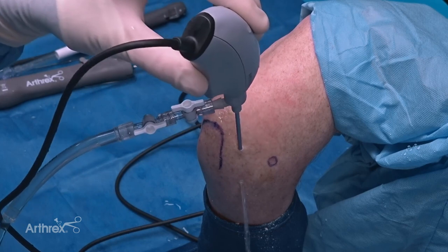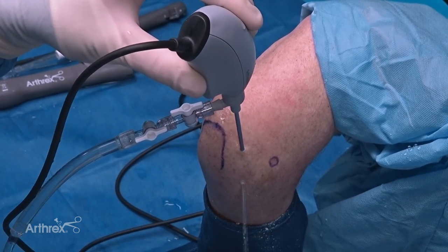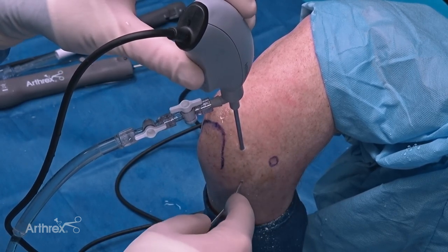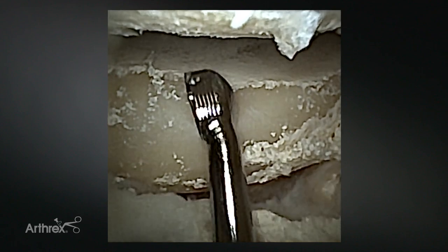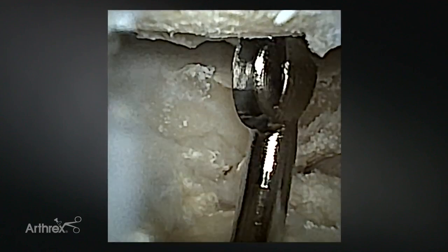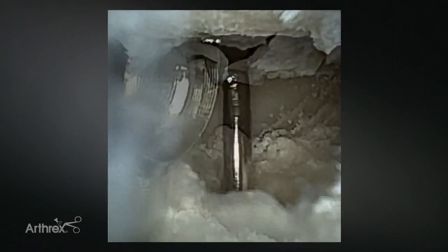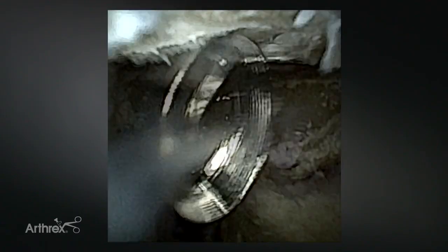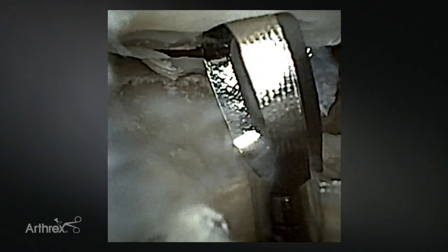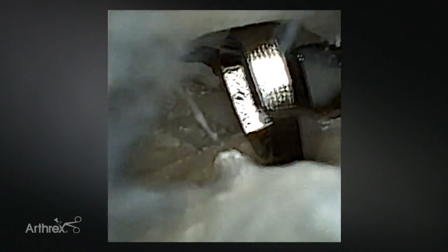Now I'm going to use the nano arthroscopy bone preparation instruments to demonstrate how we could prepare a capitellar OCD lesion. These instruments come straight but I've already bent them to fit the contour needed for this patient. I'm going to come in from the soft spot portal - these are single use instruments, so you can really get a feel and appreciation for how sharp they are. I'll use the cupped curette to debride the remaining cartilage, and I'll also demonstrate the ringed curette, which we've also bent using the bending tool. Very sharp edges, so this can be really helpful for creating a very sharp, well-defined border.